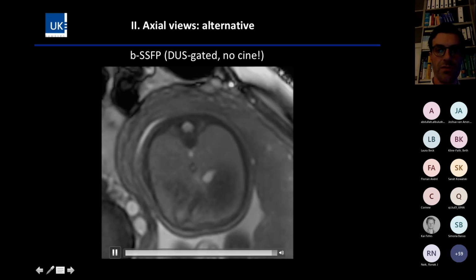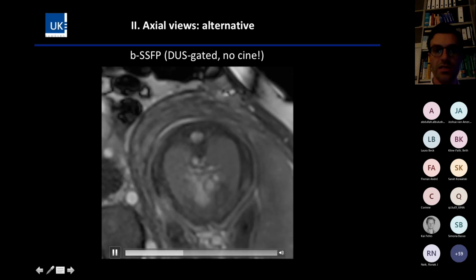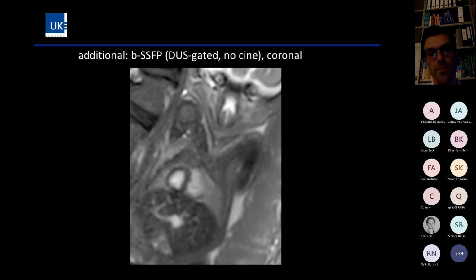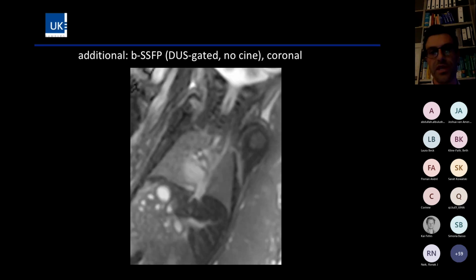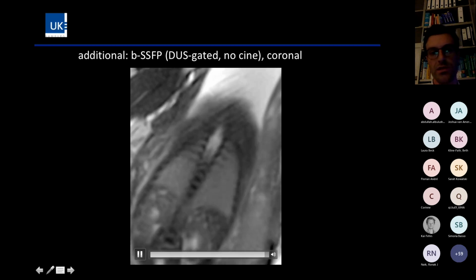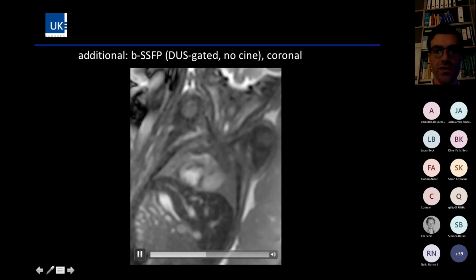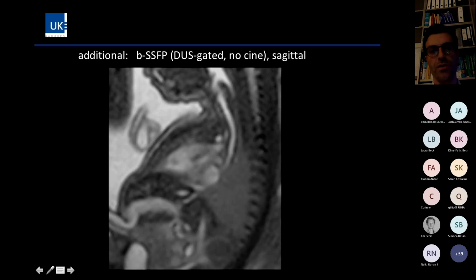is quite comfortable because you see all the interesting structures in these transversal slices. And of course, you can do this in other orientations as well. So in addition to this transversal stack, you can perform these coronal stacks, where you can also see the great thoracic vessels with the aorta, pulmonary trunk, and the cardiac chambers to check connectivity, and also this sagittal view.